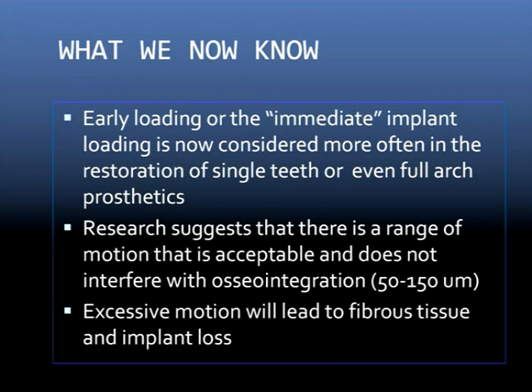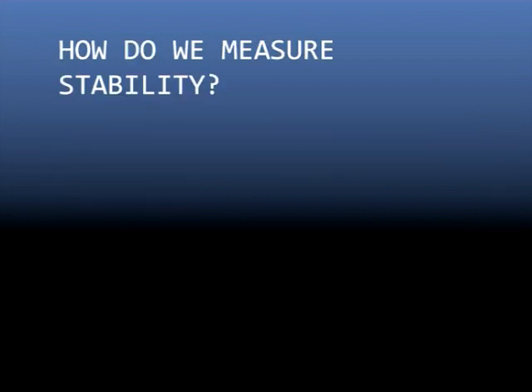So all of us in this room know that excessive motion will lead to fibrous tissue formation and obviously a failure of the implant. So the question is, how do you measure stability?